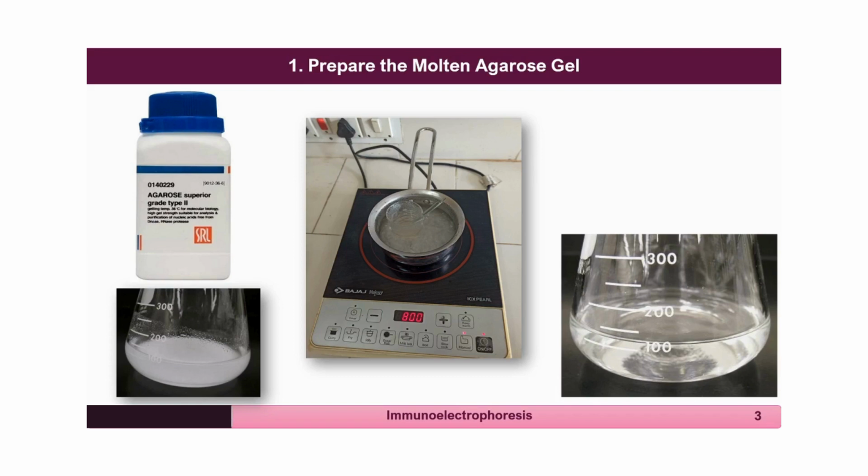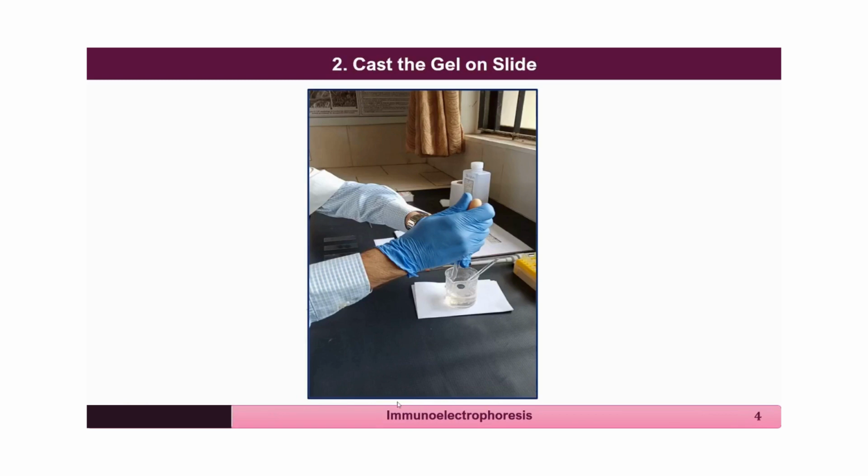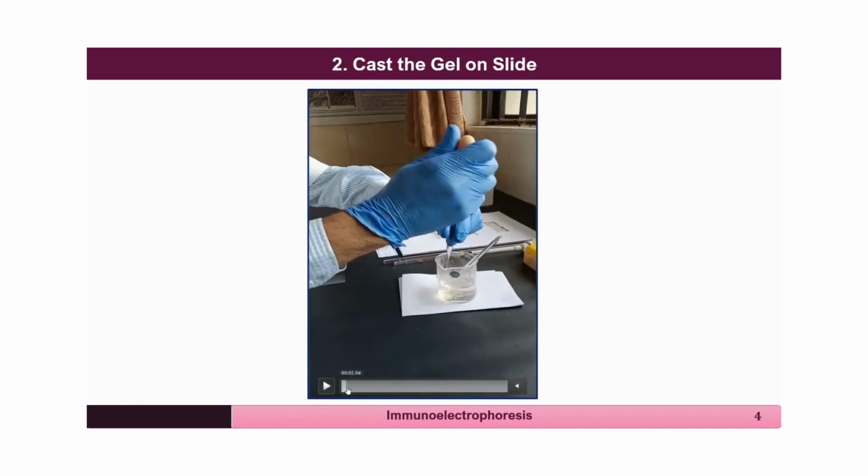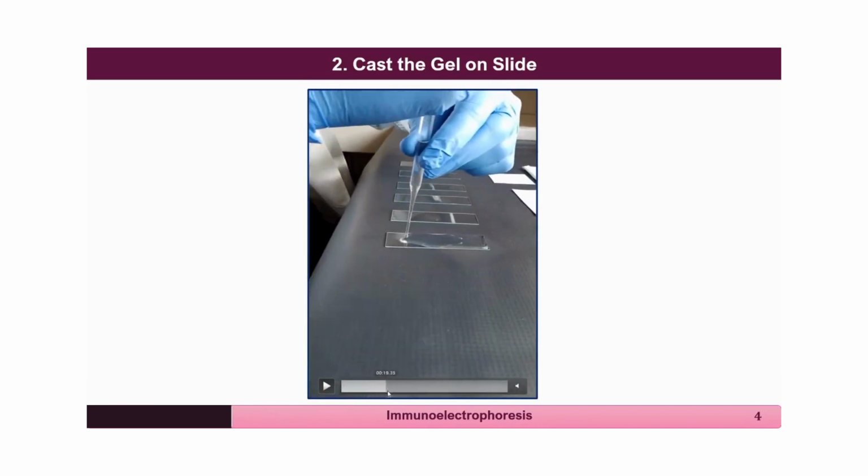One can prepare a large glass slide as it was shown for single radial immunodiffusion or for the rocket immunoelectrophoresis. And that large slide can be used for running many samples simultaneously in different regions of the slide. Or one can use a simple microscope slide on which you pour about 3.5 ml of agarose. And that agarose is allowed to solidify after pouring it on the slide as demonstrated earlier.